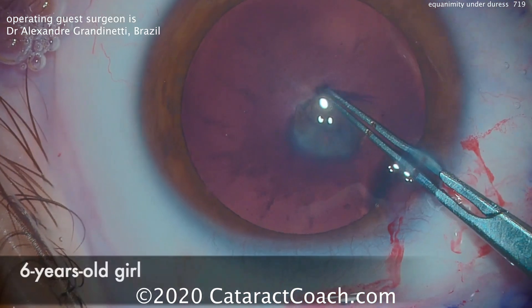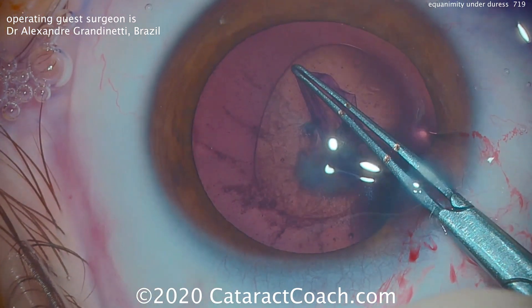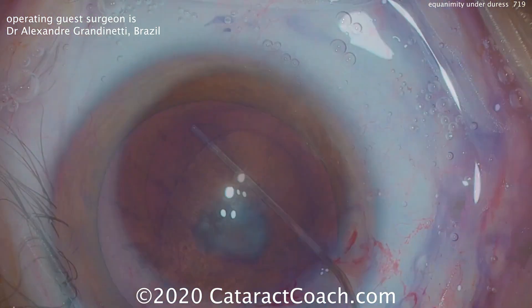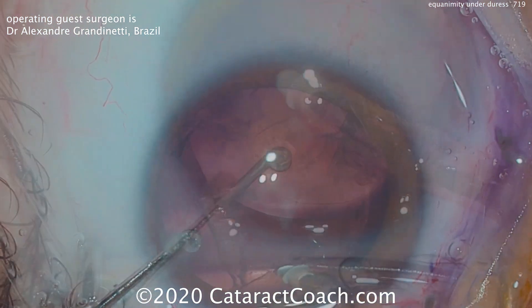This is a case of a six-year-old girl. The capsule has been stained, but even then it's very elastic and it's difficult to make a capsulorrhexis. With some good skill, that is achieved. The lens is very soft because it's a young child, so just the IA probe is enough to remove the entire lens.